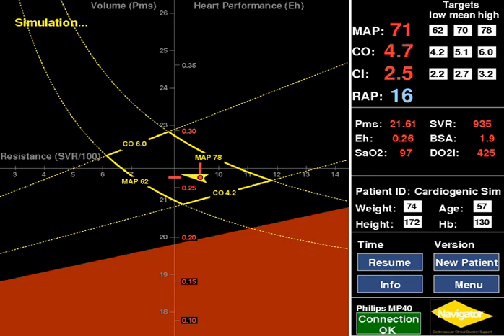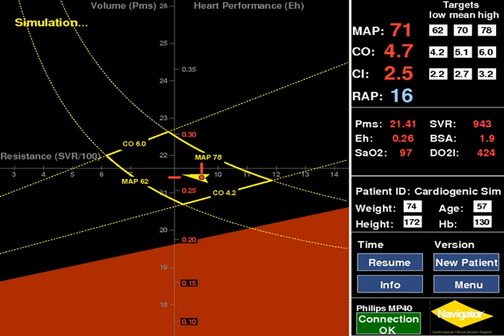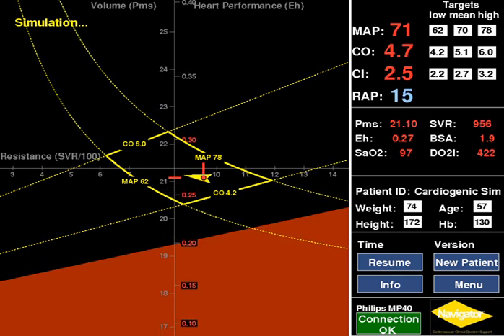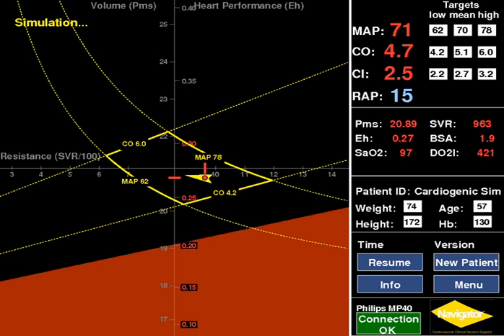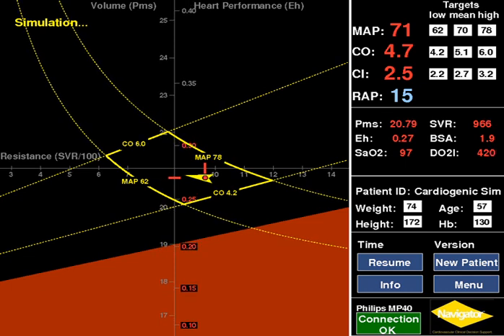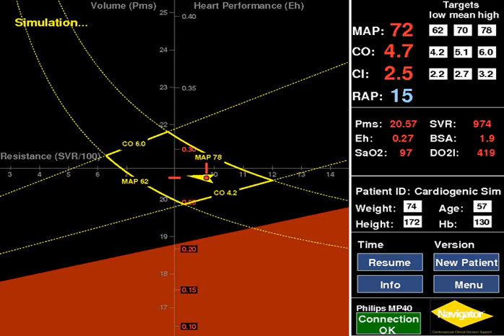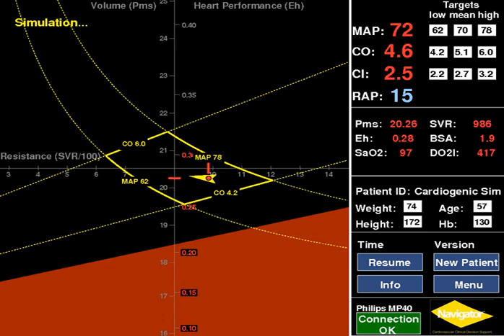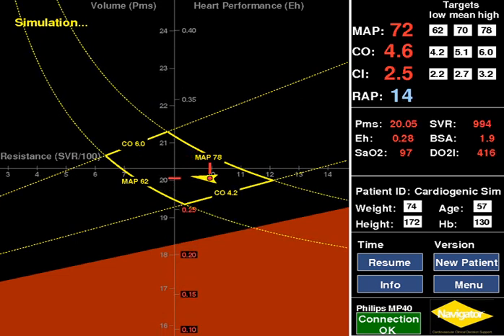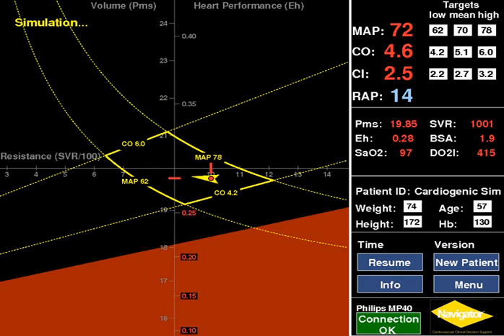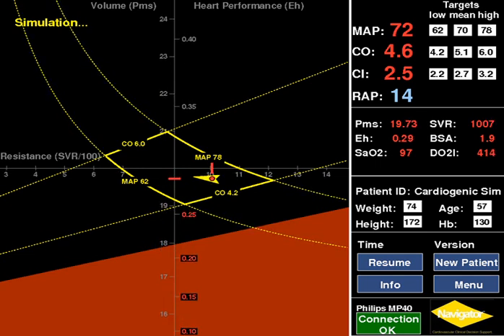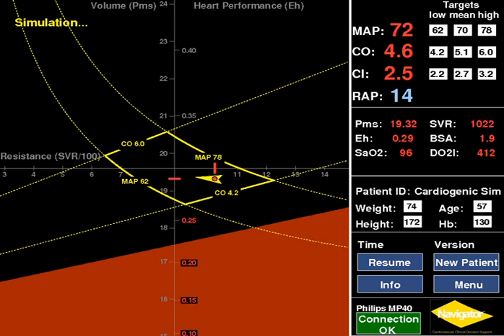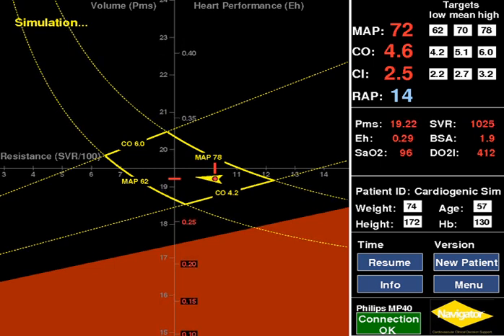The values appear in red when the EH is less than 0.3 and signify low cardiac performance. Causes may include mechanical impediments to the heart, such as pneumothorax, pericardial tamponade, pulmonary embolism, etc. In addition to intrinsic cardiac problems such as disorders of heart rate, rhythm, valves, inotropy (systolic dysfunction), and lusitropy (diastolic dysfunction).